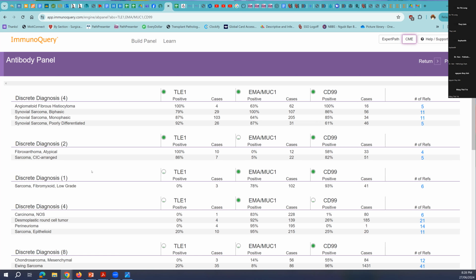So that's kind of my evaluation on this tumor. I'm not the most expert in soft tissue tumors, although I'm trying to become more so. And this is a good kind of evaluation for me to show you what goes through my mind and other things that I'm concerned about, and how I would approach and sort out to find the best answer.